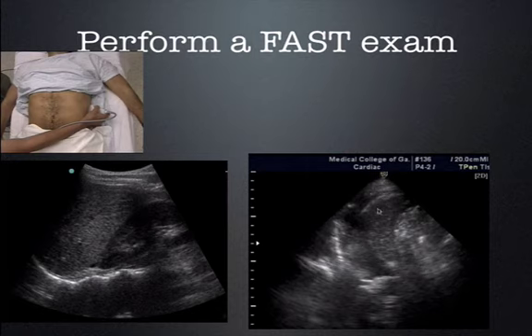Here's a positive finding. Here's the spleen, here's the diaphragm, here is free fluid between the diaphragm and the spleen. This would be a FAST positive case.